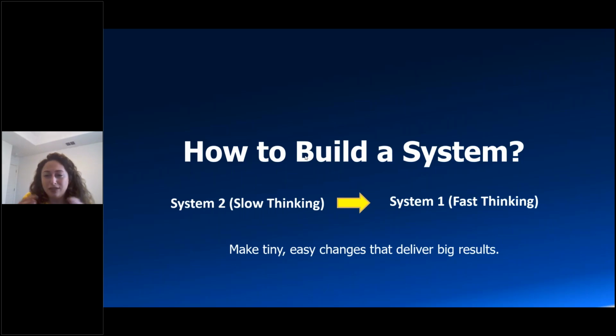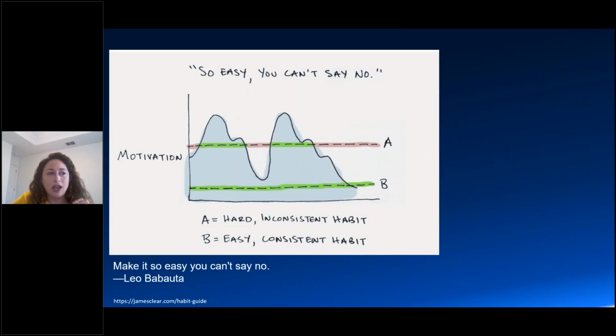So when it comes to cone beam, these small changes really relate to the location where you're looking at your CBCT scans. Is it in your office? Are you fluctuating every time? Because to create a system, we need consistency. So look at the scans every time in the exact same location, same PC.